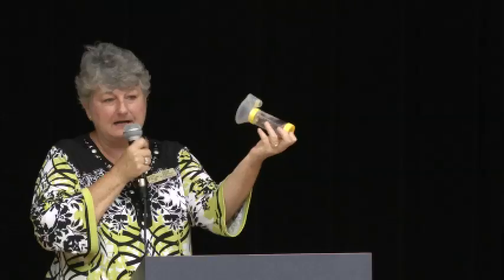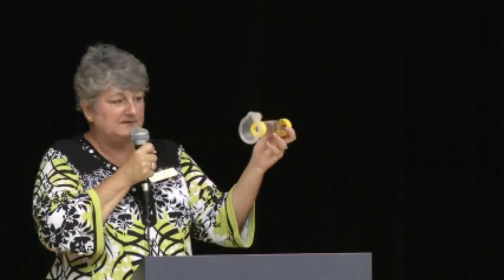This is another similar device that you'll see younger kids use. Again, you shake it up, you put the inhaler in the back area. The child that uses one of these, of course, it goes over their nose and mouth. They're for younger kids that have a hard time differentiating where they take that breath out of, if they breathe in through their nose or their mouth. So this way it doesn't make any difference. Put it over their nose and the mouth, puff on the back end, the medication stays in the chamber. And again, these are usually younger kids, so we just tell them to take 5 or 6 normal breaths in and out, remove it, wait the 1 minute, and then do the second puff.